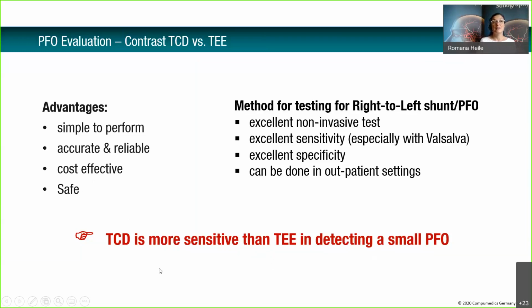I think it's more reliable to use TCD because of the acceptance.